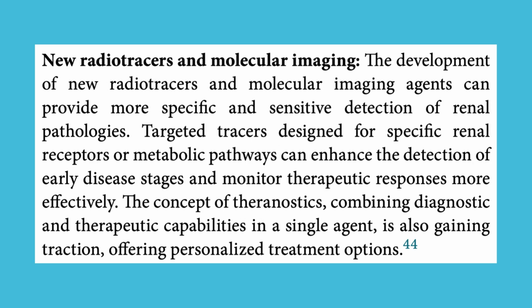New radiotracers and molecular imaging. The development of new radiotracers and molecular imaging agents can provide more specific and sensitive detection of renal pathologies. Targeted tracers designed for specific renal receptors or metabolic pathways can enhance the detection of early disease stages and monitor therapeutic responses more effectively. The concept of theranostics, combining diagnostic and therapeutic capabilities in a single agent, is also gaining traction, offering personalized treatment options.